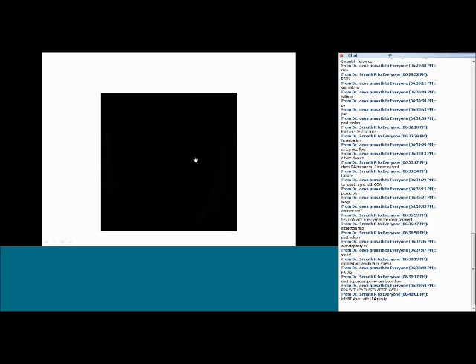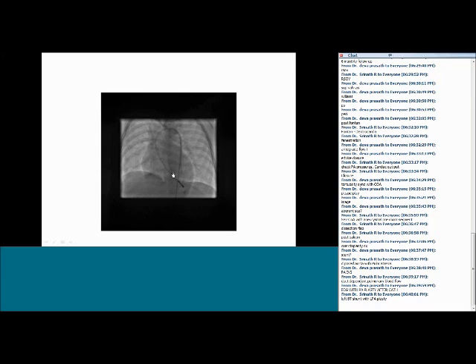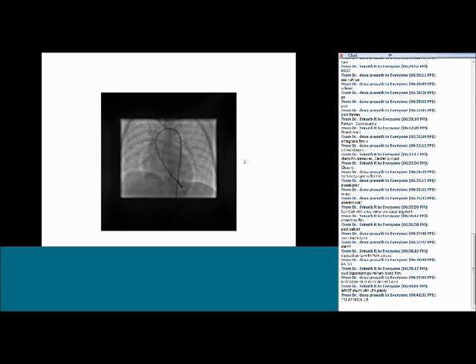Okay, last angio for the day. Please think carefully and give a good diagnosis. One diagnosis, not in parts. Good. That's fine. So this is a tricuspid atresia with restrictive VSD with pulmonary stenosis.